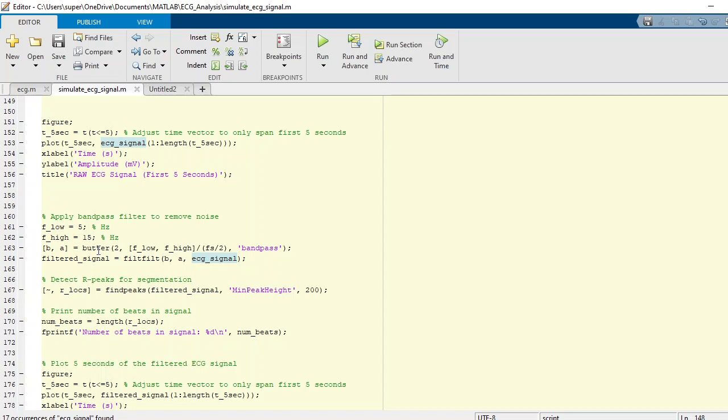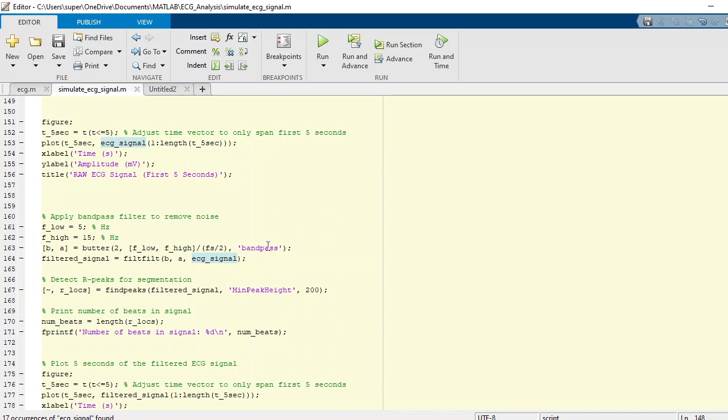What we are doing here is we apply coefficients and the low and high frequencies divided by Fs divided by 2, and we need a bandpass filter. What that filter returns is it returns B and A coefficients which you can use in your filtration function. In our case, the filtration function is filtfilt, which we apply with B, A, and ECG signals.